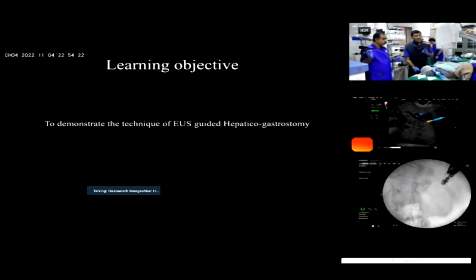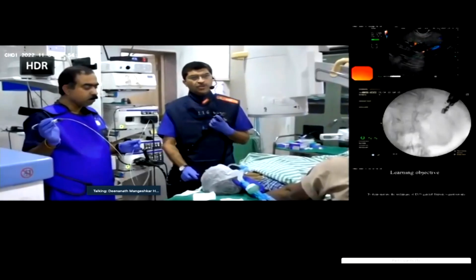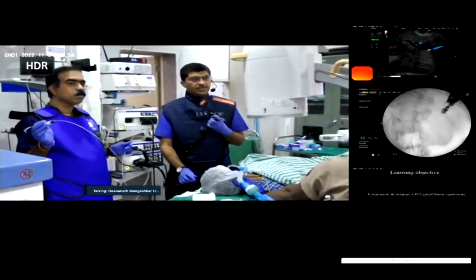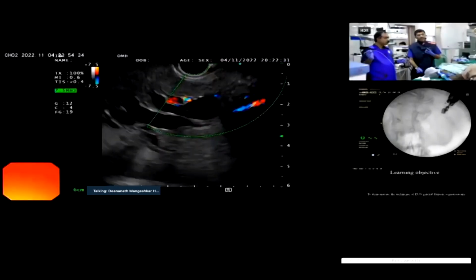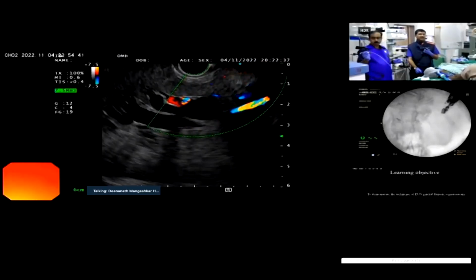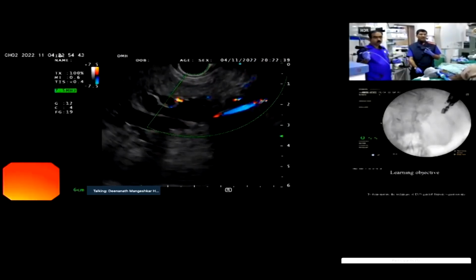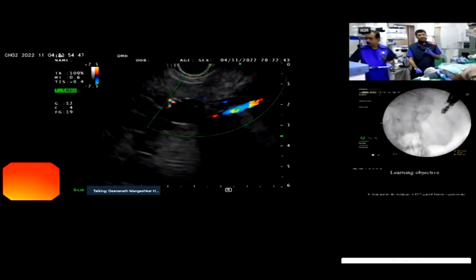Okay. Hi. Good evening. Mahesh, am I audible in the auditorium? Yes, sir. Right. So as the history presented by Rohan, this is a patient with obstructive jaundice, and we have to try and drain the left system because the right has been drained with ERCP, and we were unable to negotiate the wire.